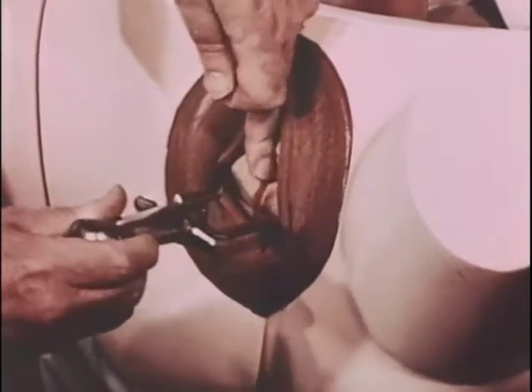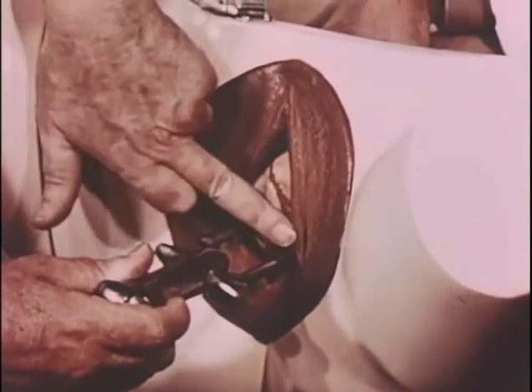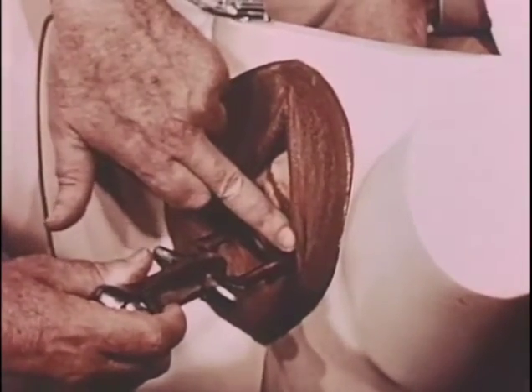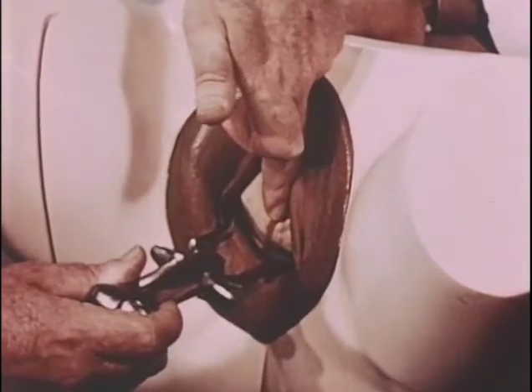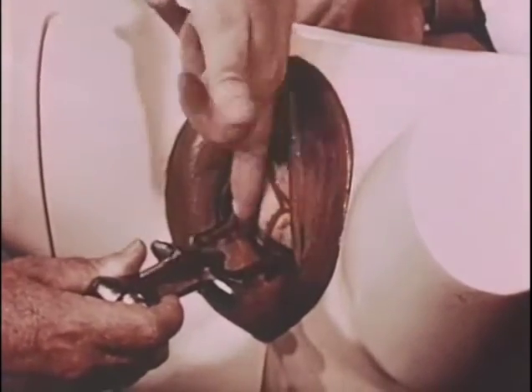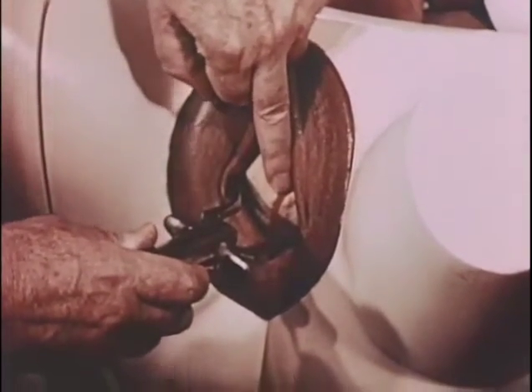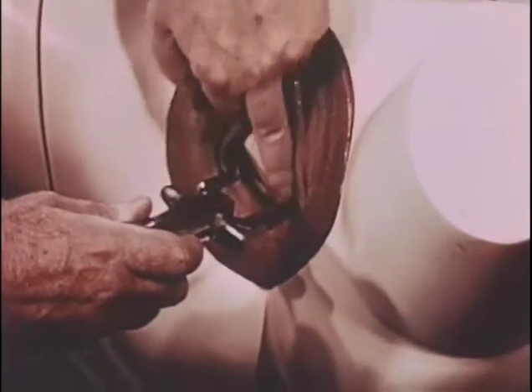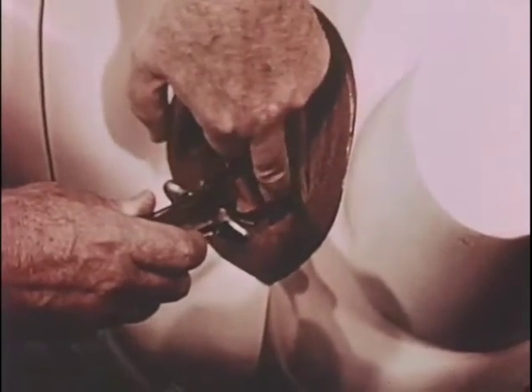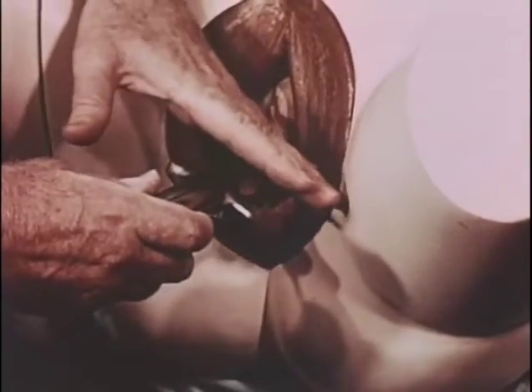The posterior fontanelle, the Y, should be a finger's breadth anterior to the plane of the shank, and it should be equidistant from the sides of the blades. The sagittal suture, throughout its length, is perpendicular to the middle of the perpendicular plane of the shanks.